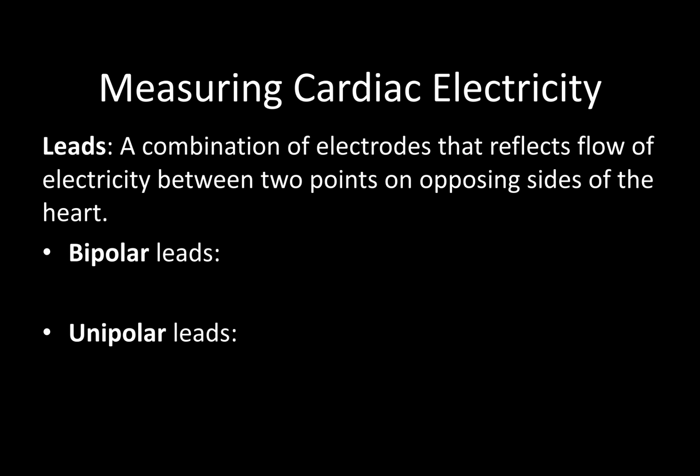So your bipolar leads, these are ones that have a true negative and a true positive on each end. And that's going to be leads 1, 2, and 3, the truest ones. And when I'm talking about these, I want you to continue thinking about the standard layout. And in subsequent slides, that'll make a little more sense.